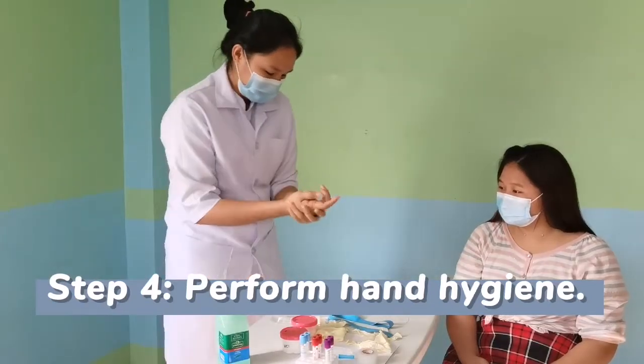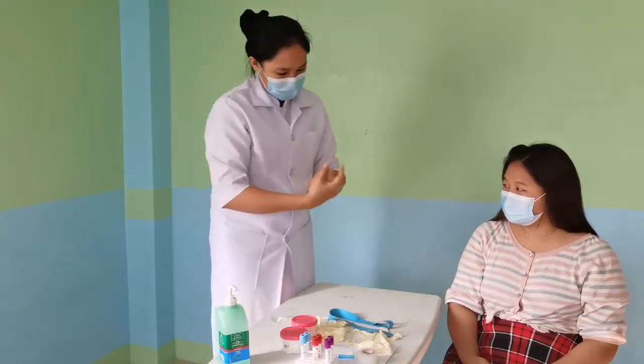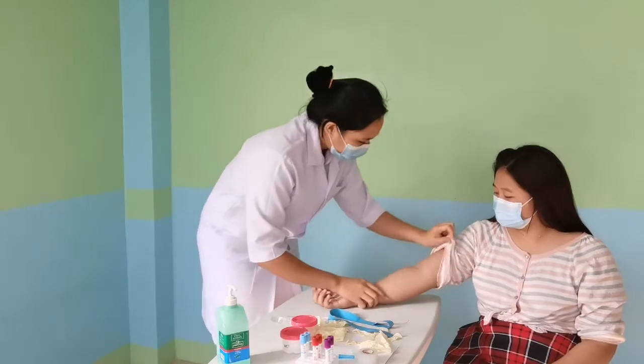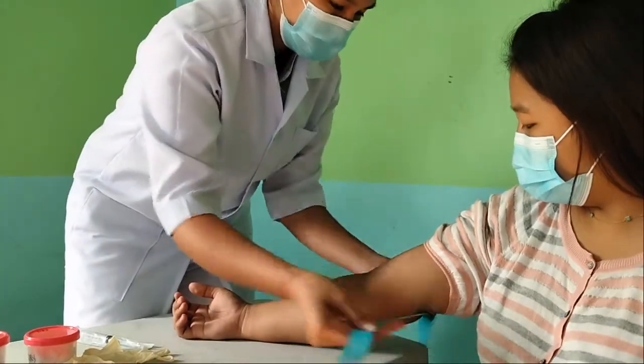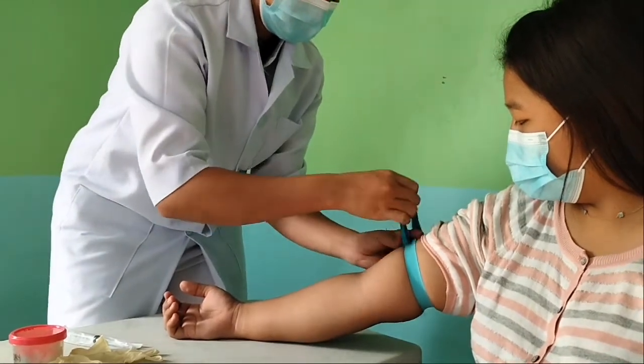Then, perform hand hygiene. Pull the sleeves upward if the patient is wearing long sleeves. Then apply the tourniquet. Make sure it's not too loose or too tight.